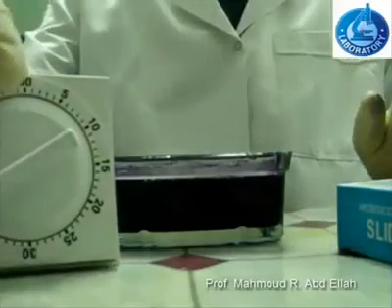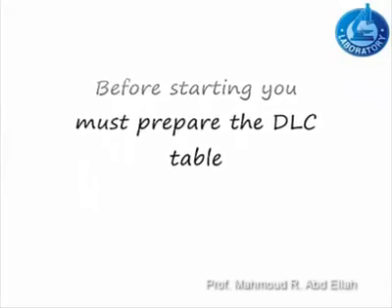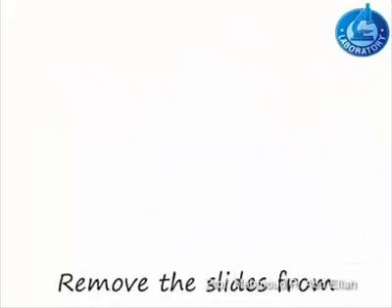Before starting the differential leukocytic count, prepare the differential leukocytic count table. Also, you can count the cells under the microscope using a differential counter.